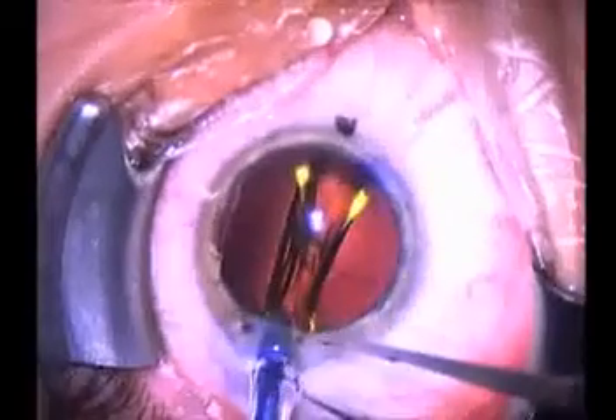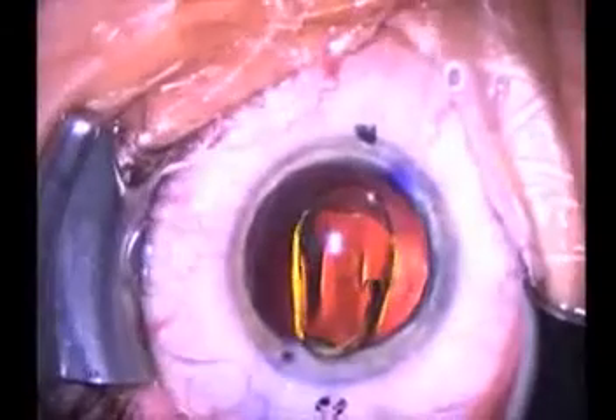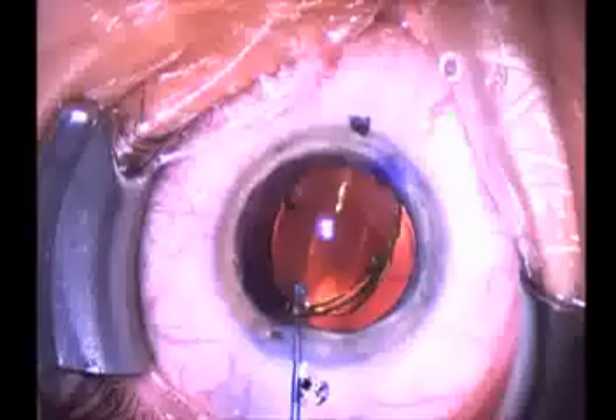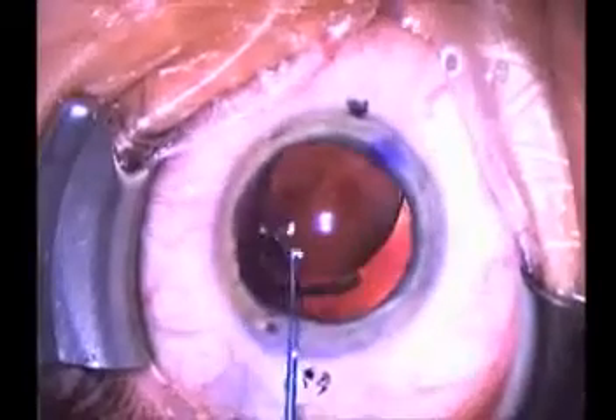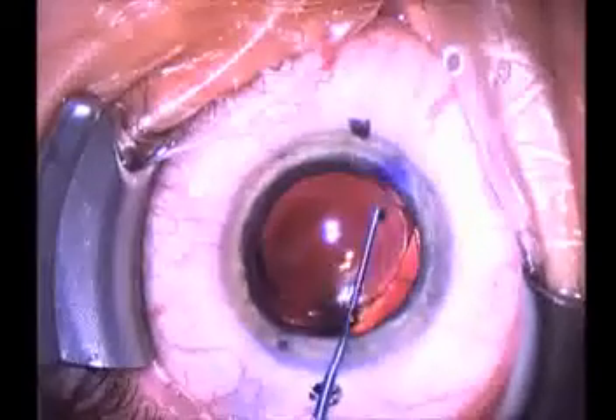You see the lens being injected through a very small 2.4 millimeter incision. This amazing design unfolds gently inside the eye. And we are now going to rotate that lens into its proper orientation.